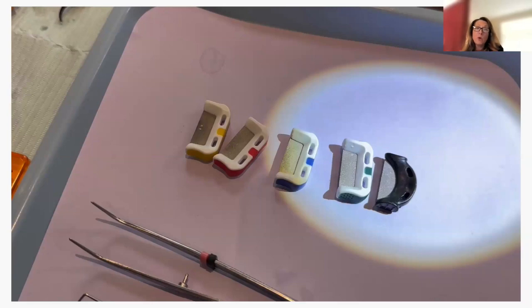You can always give the patient ortho wax that they can put on when they don't have their aligner in, not too hot of soup or else it'll be a waxy mess, but to be able to eat until they can build up the tolerance of the change in their mouth. But like I said, even the patient here, she said, oh, these are more comfortable. I like it better in.